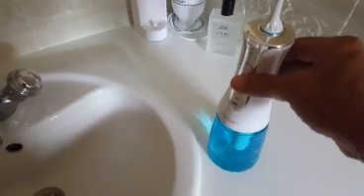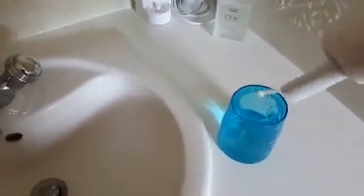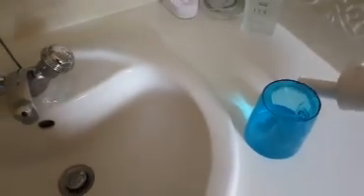Once you've finished using it, it's recommended to empty the water completely from the unit and then run it briefly to get rid of any remaining water, so there won't be stale water left in the unit.